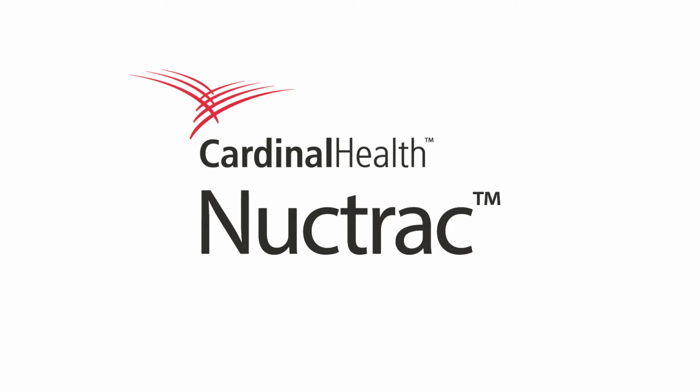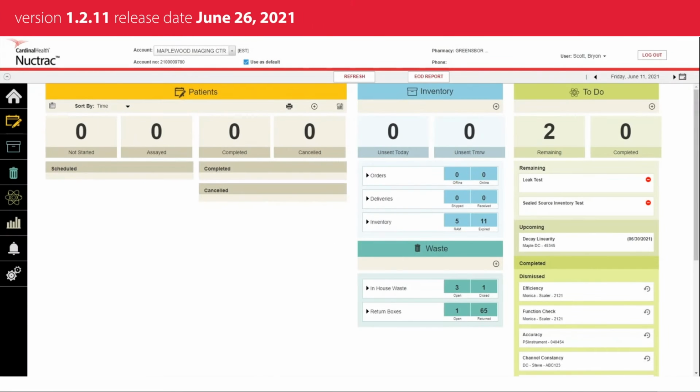Welcome to this month's video of enhancements for Nuctrac version 1.2.11, scheduled for release on June 26th. So there's only a couple items that we really need to review this month, and they're really around sealed sources.